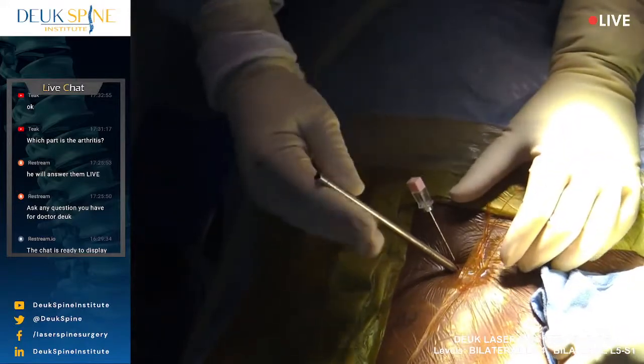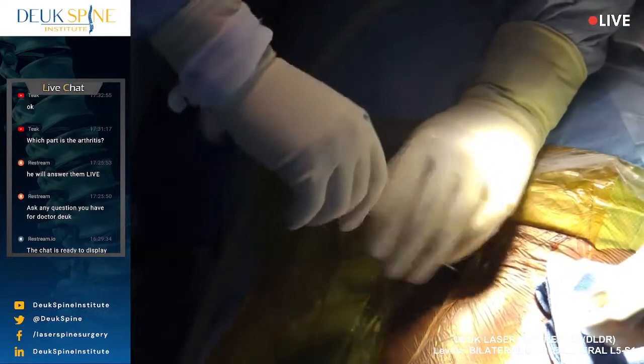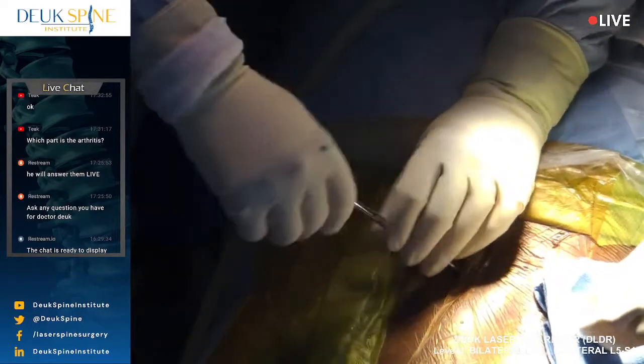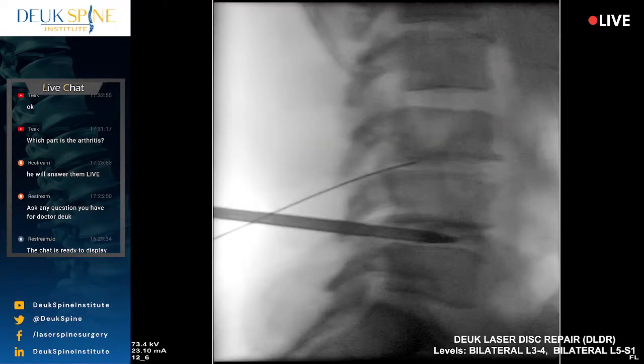Is my incision too small? I was barely fitting this tube. The incision is like 6.8 millimeters. The tube is 7. Shot. So I'm just stretching it a little bit. Not a big deal. We're just trying to keep the incisions as minimally invasive.